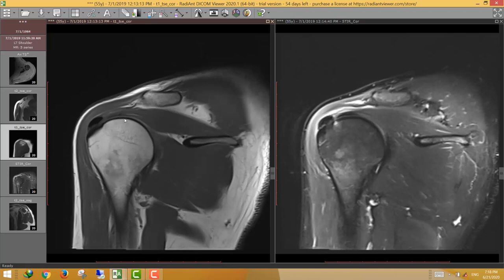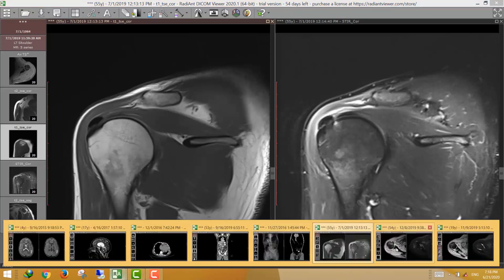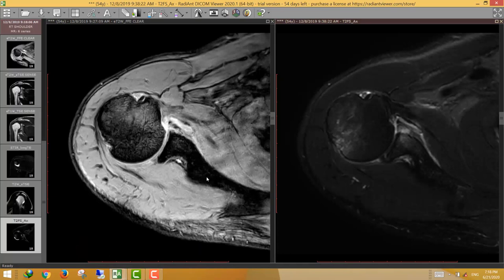This is characteristic of calcific supraspinatus tendinopathy. When you see a resistant dark signal lesion in different pulse sequences, suspect calcification along the supraspinatus — calcific supraspinatus tendinitis. It is much easier to appreciate on CT or X-ray than on MRI.